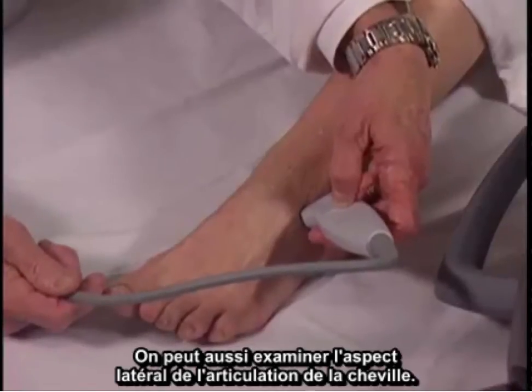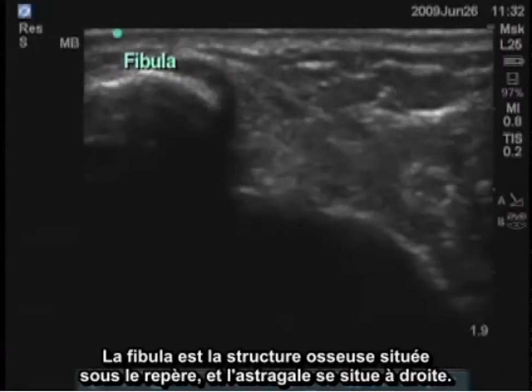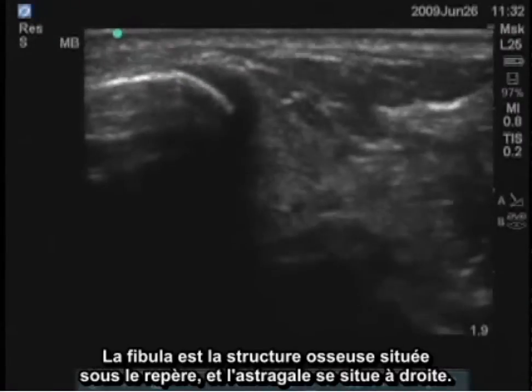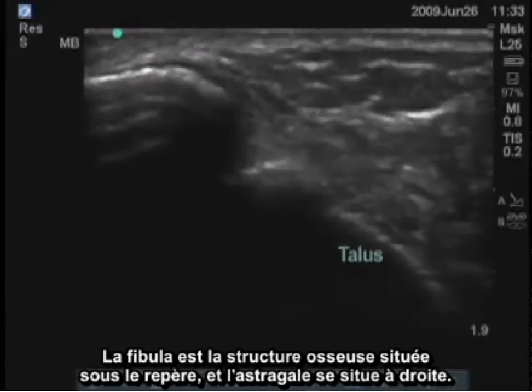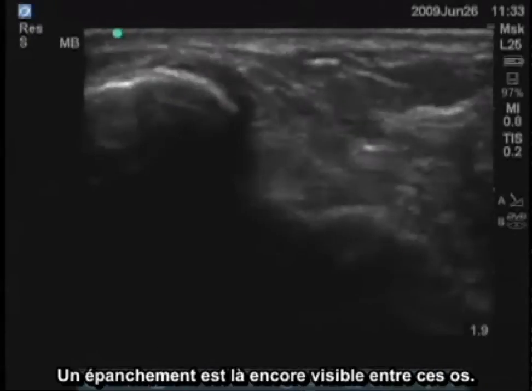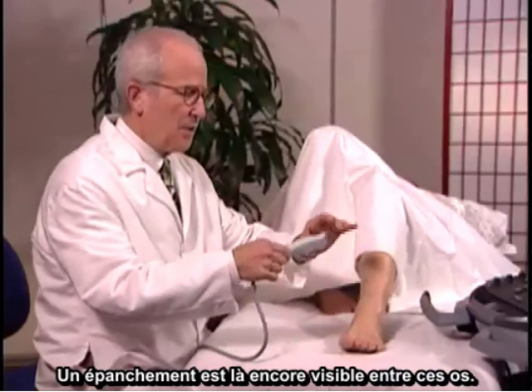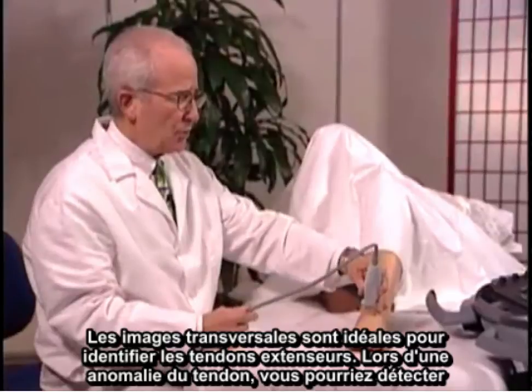The lateral aspect of the ankle joint can also be examined. The fibula is the bony structure underneath the marker, and the talus is to the right. You can see an effusion again between those bones as well. Transverse images are very good for looking at extensor tendons and for tendon abnormalities.